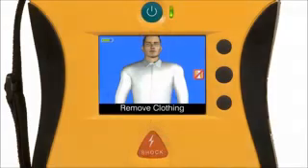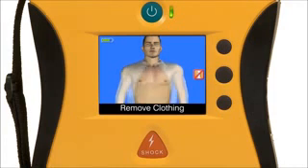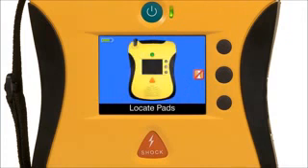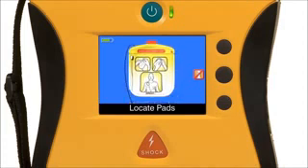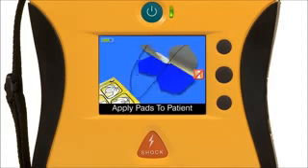The first step in successfully using an AED is to place the pads in the proper position on the patient. The video shows you step by step how to prepare the patient, find the pads, locate pads package in back of AED, connect them and exactly where to place them.